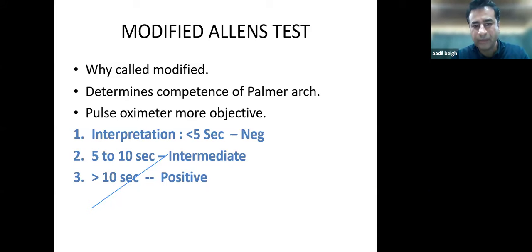You put a Doppler on the palmar arch. You see the peak systolic velocity of the palmar arch, the peak systolic velocity of the ulnar artery and radial artery. See the degree of calcification. See the hyperemia, we can discuss it in the ultrasound. After making a fist and releasing it, see how much blood is going to the palmar arch. If it is okay, then you can create a fistula.